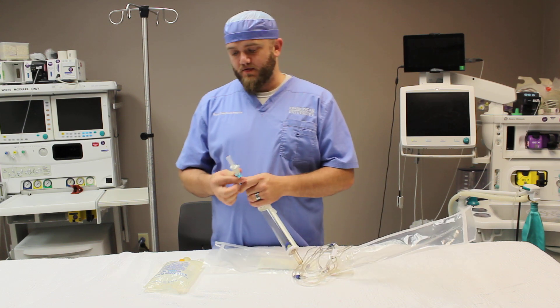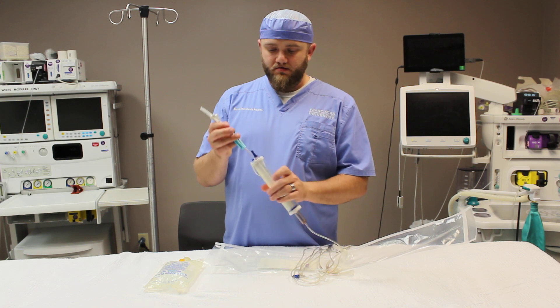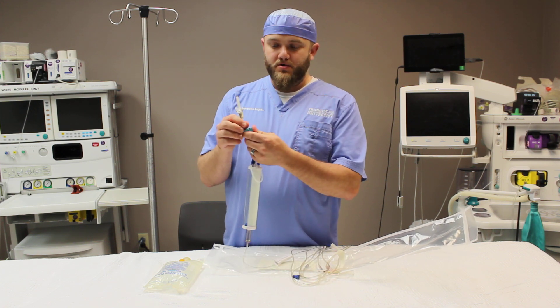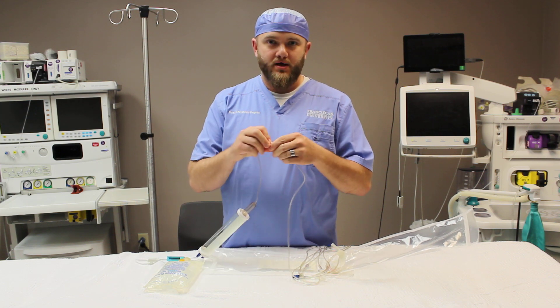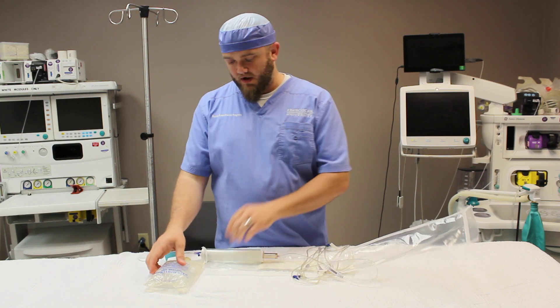When you first go to set up this system, you want to make sure your airway lever is closed, close the on-off lever, and close the regulating roller clamp.